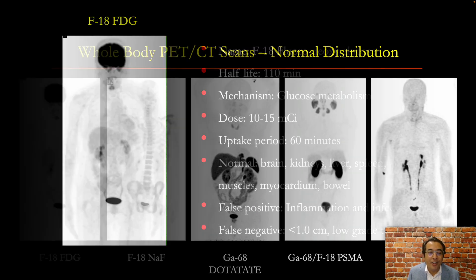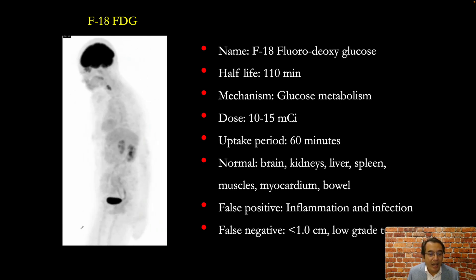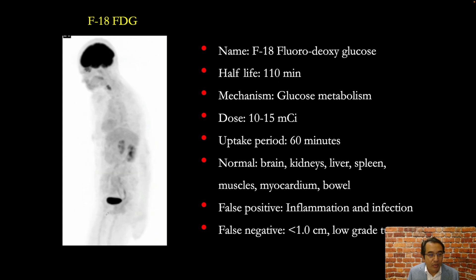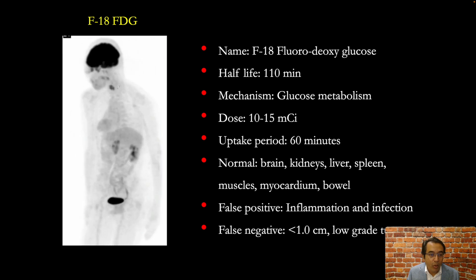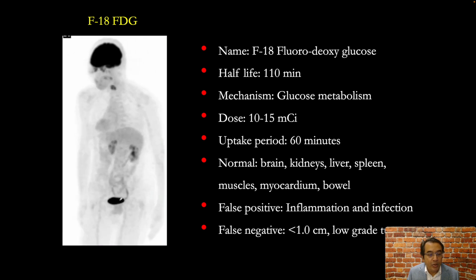Let's get started. This is our first whole body image from a FDG PET-CT scan and we are looking at physiologic distribution of the tracer: intense activity in the brain, some activity in the extraocular muscles, vocal cords, tonsils, faint activity in the liver, spleen, and excretion from the kidneys into the bladder.